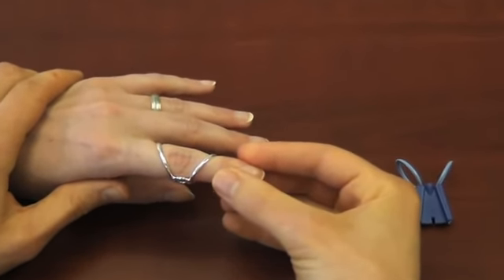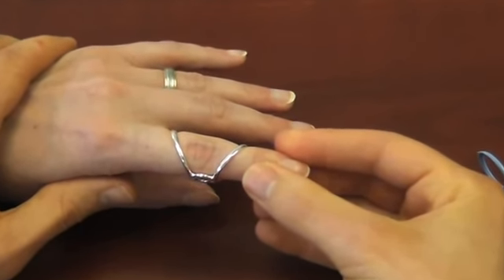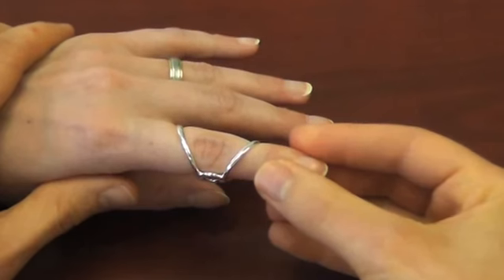The rings will probably leave indentations in the finger, but that is to be expected as long as the ring is not cutting off circulation and is not causing a painful pressure sore.